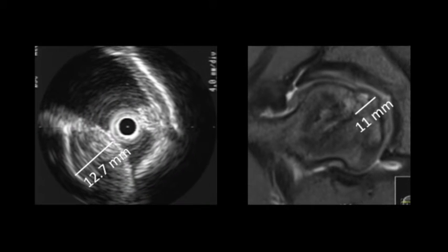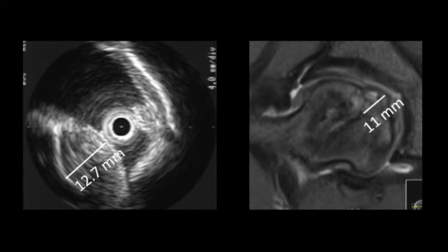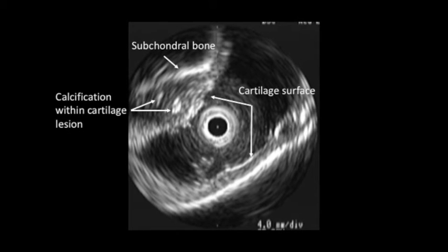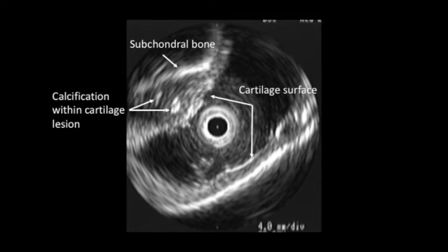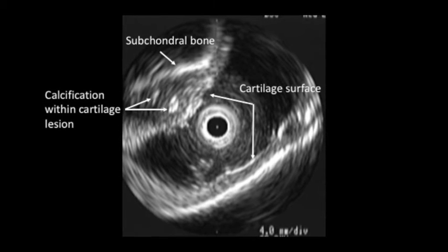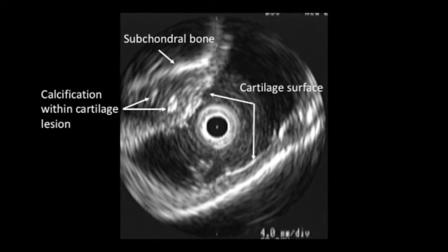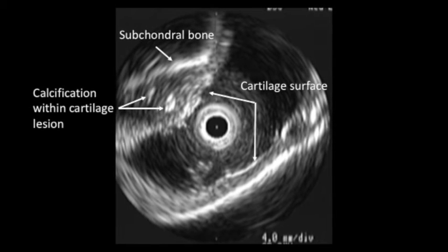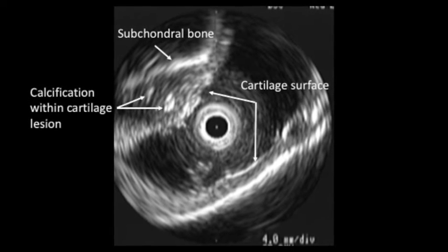The ultrasound measurement of lesion depth was in line with that measured from MRI. In addition, the calcified layer within the OCD lesion was clearly visible in the ultrasound image and no fluid was detected beneath the cartilage layer. Based on the ultrasound, hook probe and arthroscopic investigation, the OCD lesion was graded to be ICRS OCD grade 2.